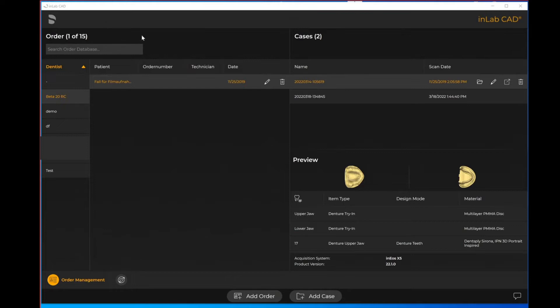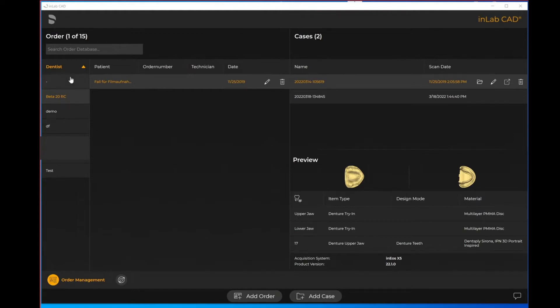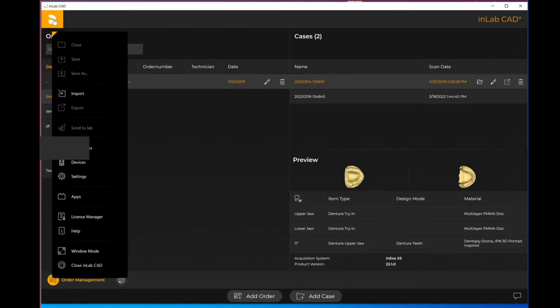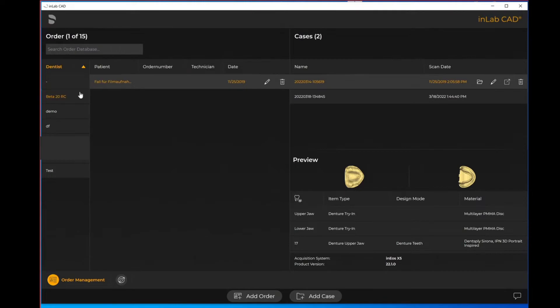When it comes to importing certain other file types, when you're on the home screen, this is the screen that's known as order management. We can see we're on that step because it's highlighted here in that orange color. When we come up to the menu button on the upper left corner, the Dentsply Sirona symbol, you can see there's an import option.